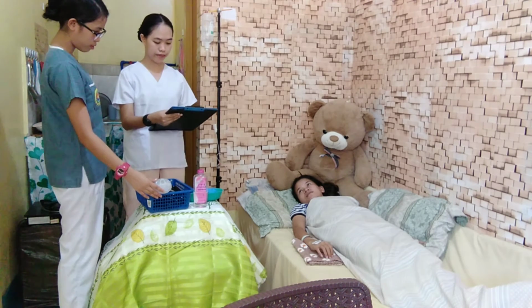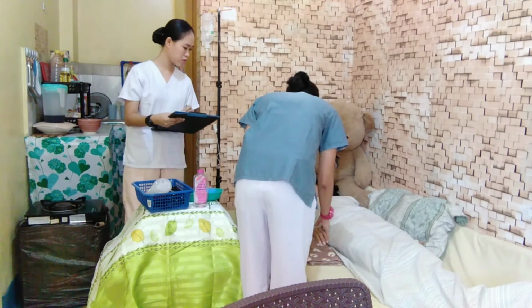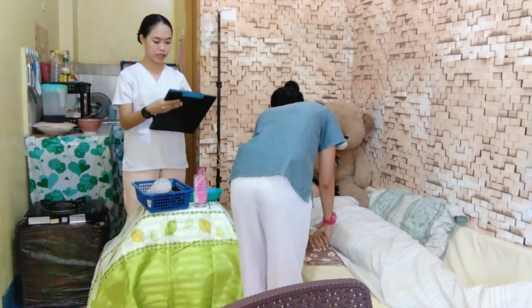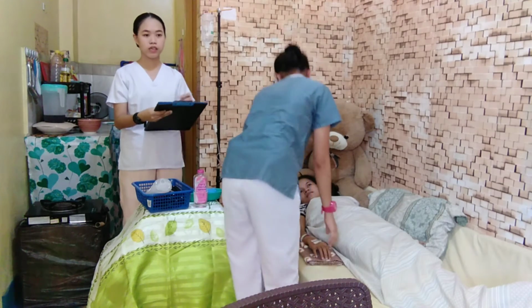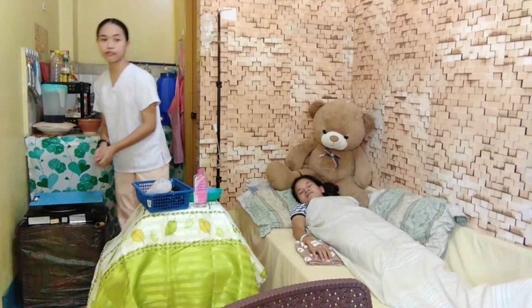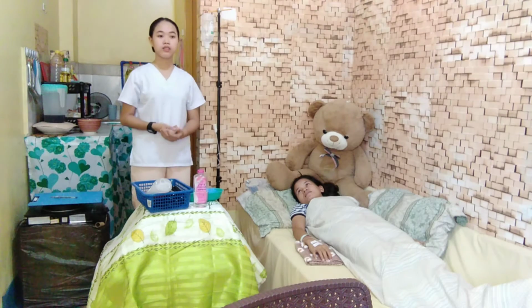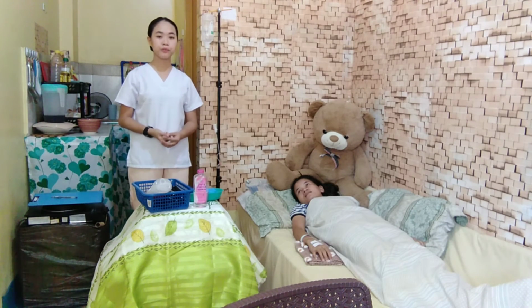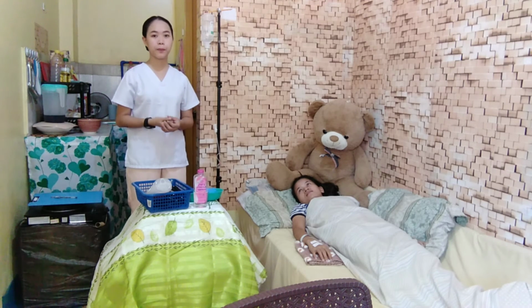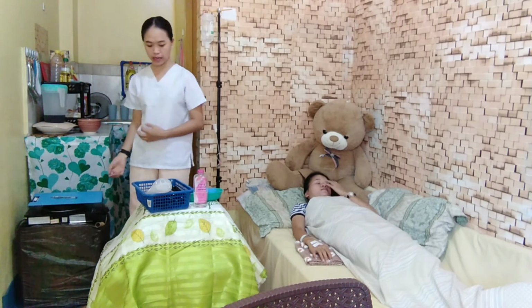Okay. So, ma'am, can you check the client's band on her left arm for confirmation? Mariam Lyrene Dumis, right, ma'am? Yes. Okay, thank you so much, ma'am. And then after checking the cross match of the blood with my colleague, I will warm the blood at room temperature before transfusion. I will ensure the privacy of the patient, and I will check the vital signs and document them on the record.